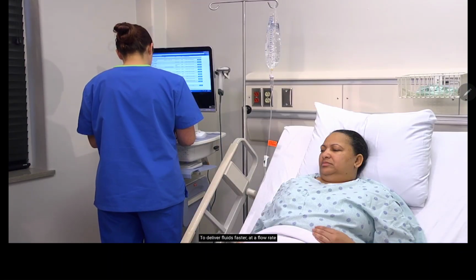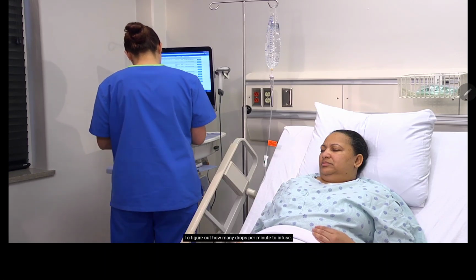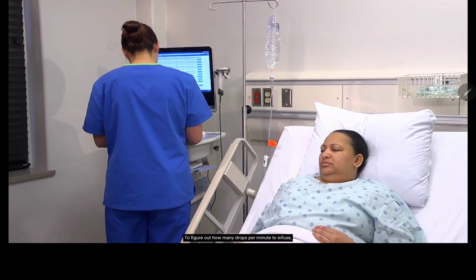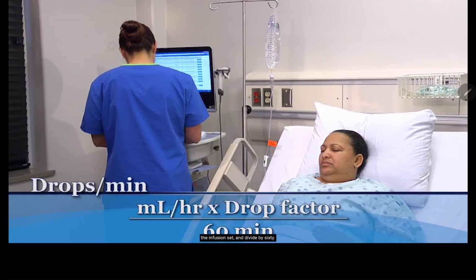To deliver fluids faster at a flow rate greater than 100 milliliters per hour, a macro drip infusion set is used. To figure out how many drops per minute to infuse, multiply milliliters per hour by the drop factor of the infusion set and divide by 60.